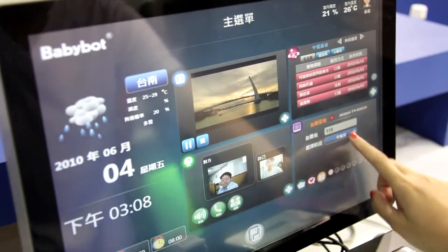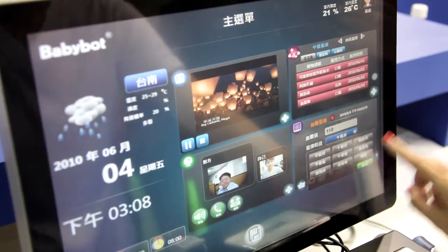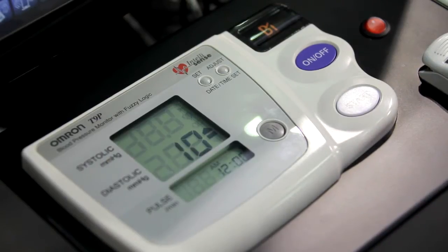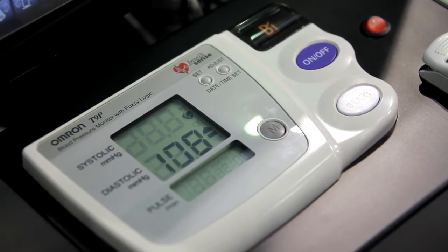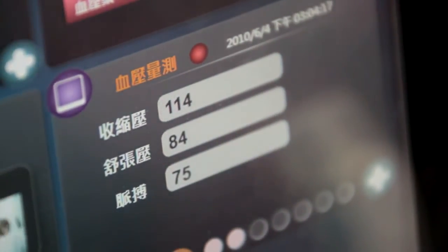Press the on/off button. Next, after the heart symbol appears on the digital panel, press the start button and remain still until the measurement is complete. When the measurement is complete, the monitor shows your blood pressure and heart rate, and automatically deflates the cuff.